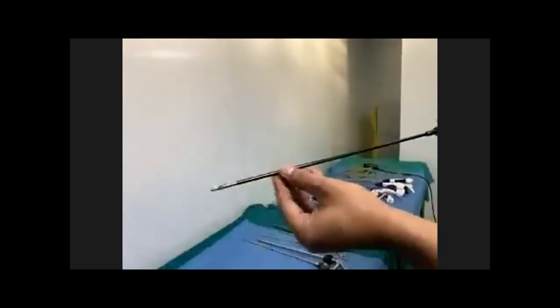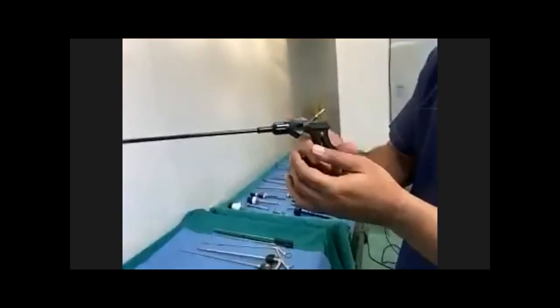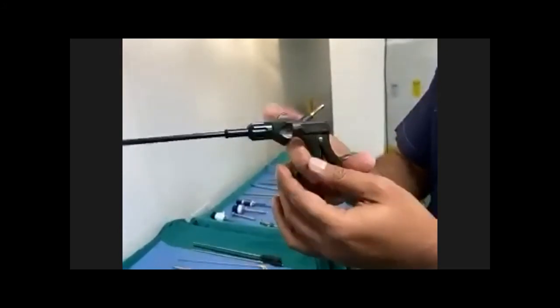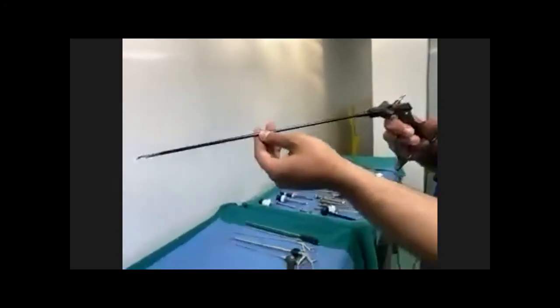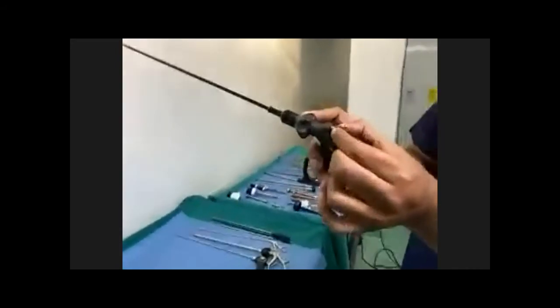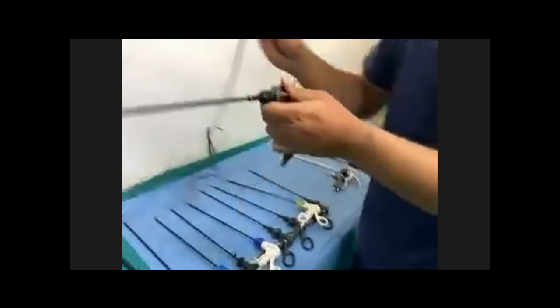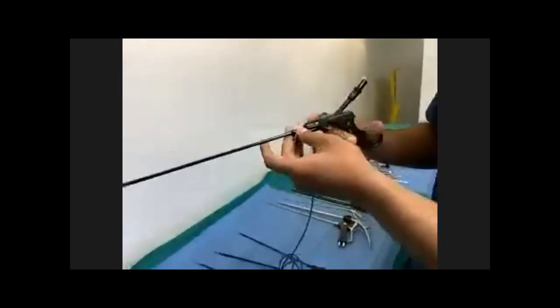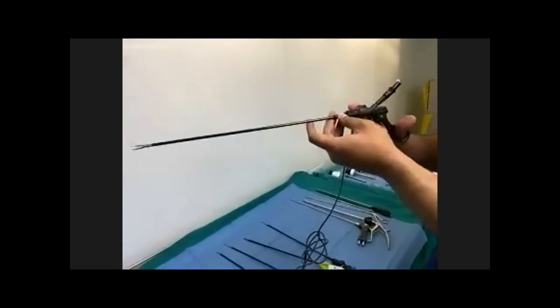It has a shaft handle, and here there is a revolving, articulating type of thing, from which we can rotate it, right? This is a knob for the rotation. Here you can see a thing which is metallic, and you can attach the cautery over it like this. So you can use it during surgery if you require any coagulation.